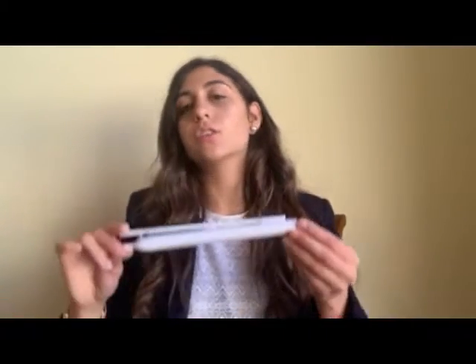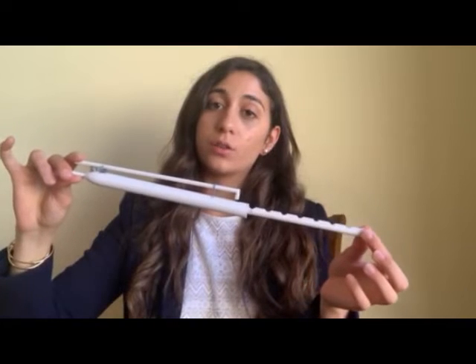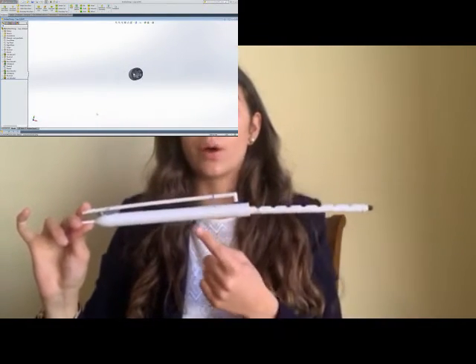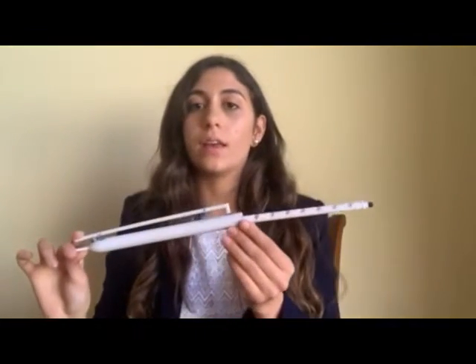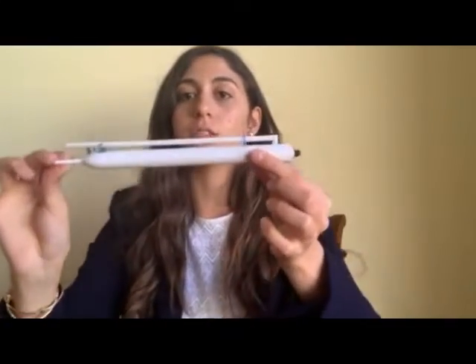In the case that the patient bites down and tilts their head forward, this inner tube could potentially fall out. So what I have done is installed stoppers on the inside of this outer tube that will catch it as it falls. This way it does not fall to the ground and the patient can simply bring it back by tilting their head and returning it to its resting position.